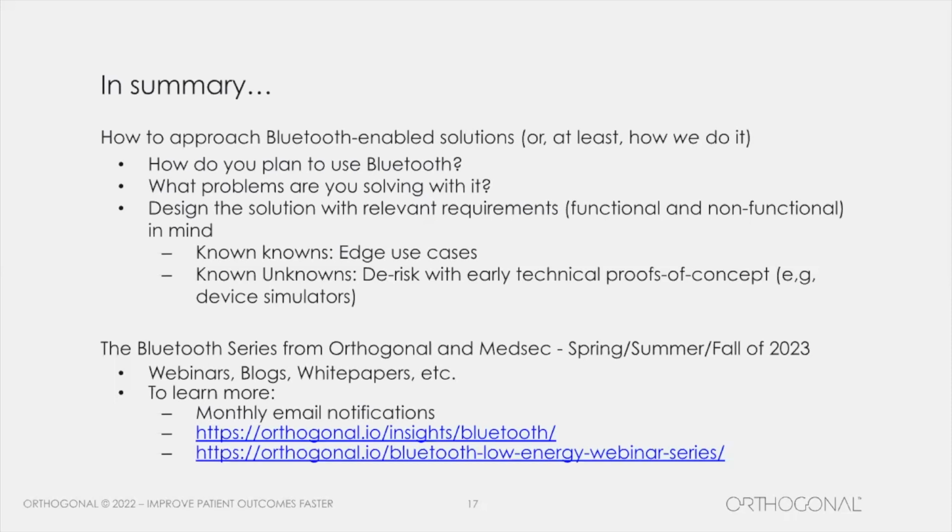So remember, this is a headless device, right? It's implanted. It does not have a button on the outside of the body. And so turning it off is a difficult thing to do there. Not impossible, but obviously if you run out of battery power, you do have external chargers, et cetera, for this.